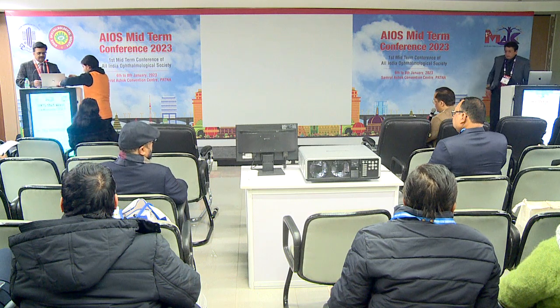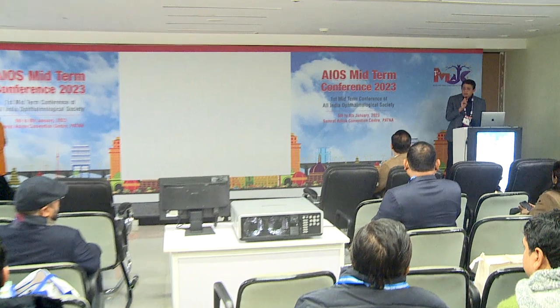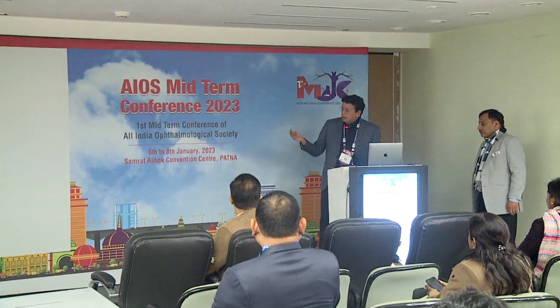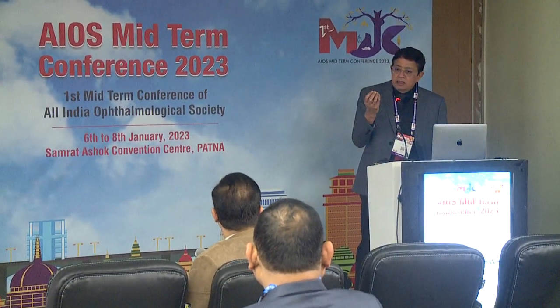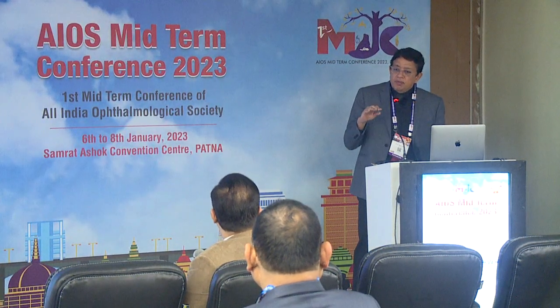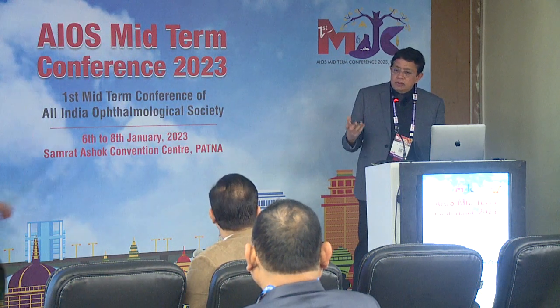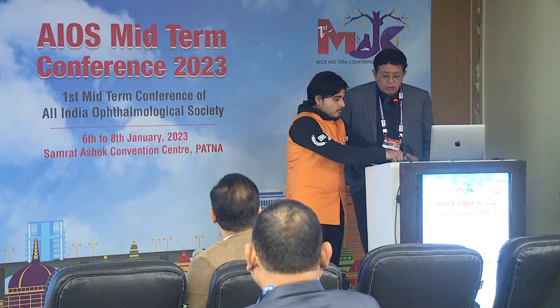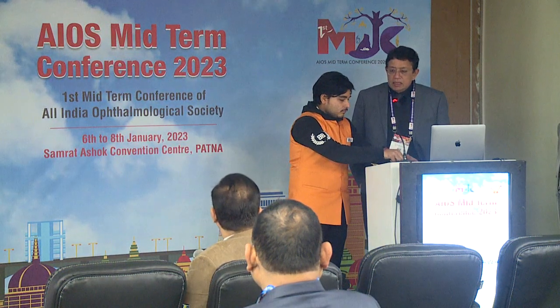Thank you very much. Thank you for your nice presentation. Regarding ASOCT, we do it in all cases. Actually, it has even been classified three ways. One is where you see a pre-existent defect and some cortical matter in the anterior vitreous. Another is where the posterior capsule seems to have fibrosed down, and is unlikely to give. Of course, as Dr. Love said, you always assume that you are going to end up with a problem, but this helps you to pre-plan and expect an issue.